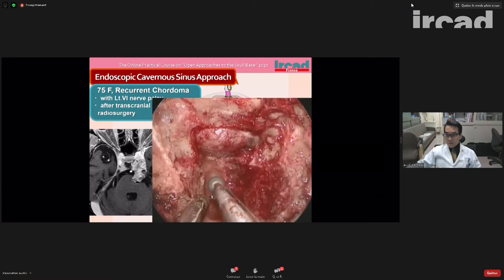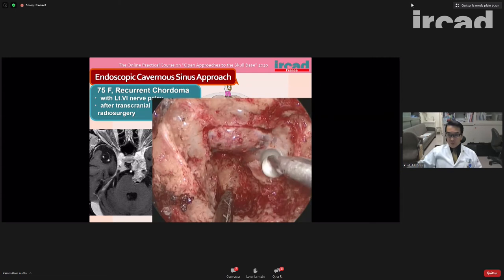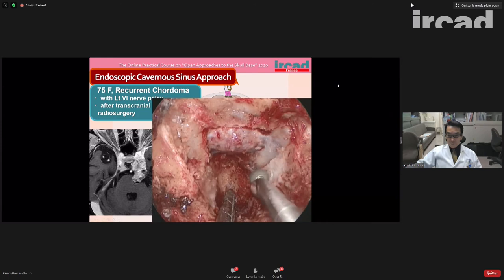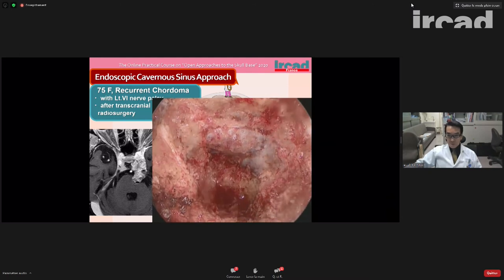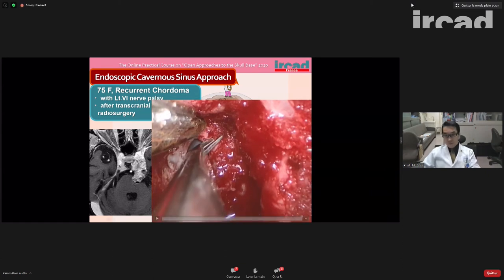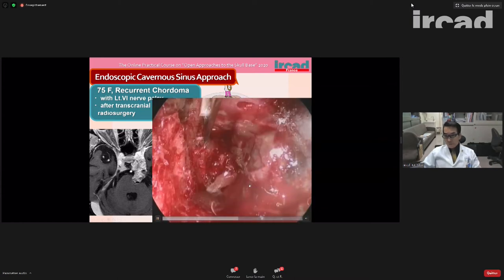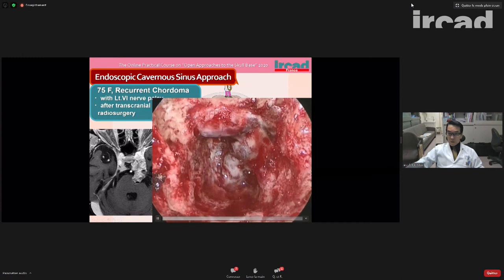So the bony structure on the cavernous sinus is also drilled off, and when we treat a skull-base chordoma, we routinely remove the dorsum sellae bone also. First we expose the dura mater on the carotid prominence, and we can see the bulge of the dural attachment here. So we start opening the dura mater here.